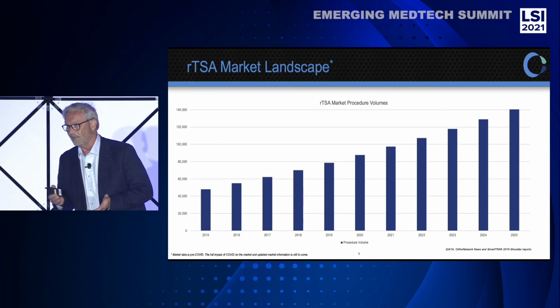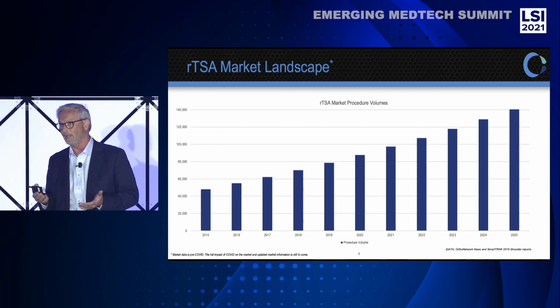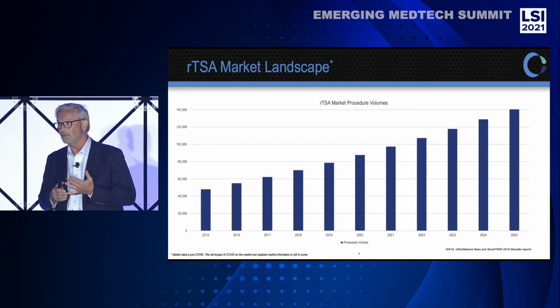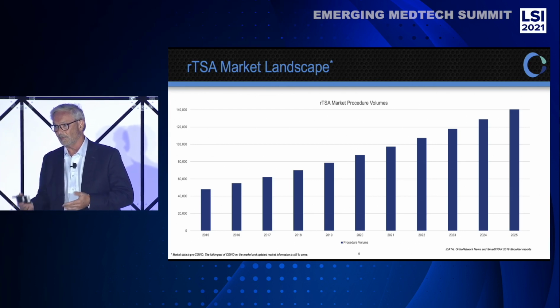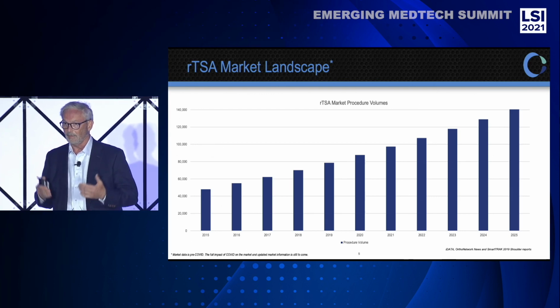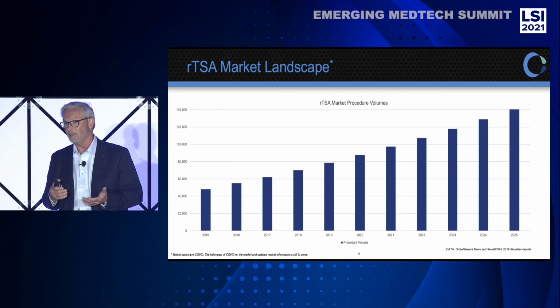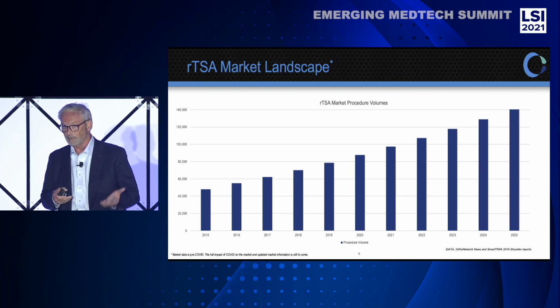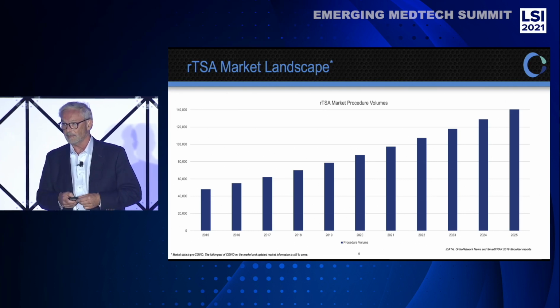I get asked a number of times what makes the surgeon make the choice. Sometimes they don't have a decision to make, because if the patient has no rotator cuff or a compromised rotator cuff, they're going to get a reverse total shoulder. If they have a rotator cuff, they're a candidate for an anatomic shoulder. What's the difference? Anatomics typically get better range of motion. That's what they really want. And we hear stories about ours all the time with people that can actually go back to normal activities within a couple of months, including golf.